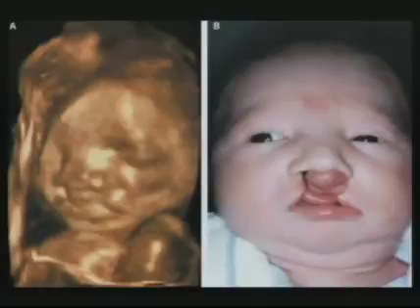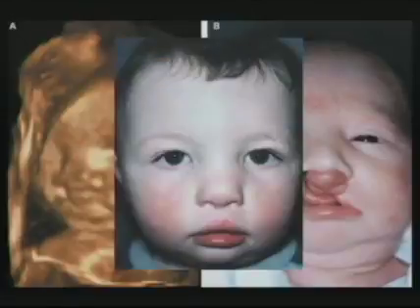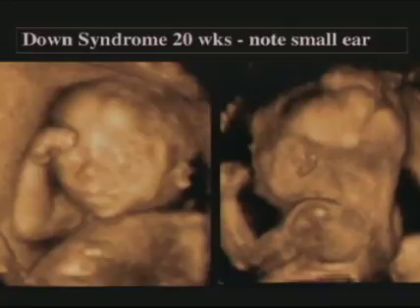And here is another fetus that had a bilateral cleft lip and palate. And just to show you how well these can be fixed by the plastic surgeon, this is the child after it had the surgical repair. Really a superb outcome. Now let's look at some ears and look at some dysmorphology of ears.